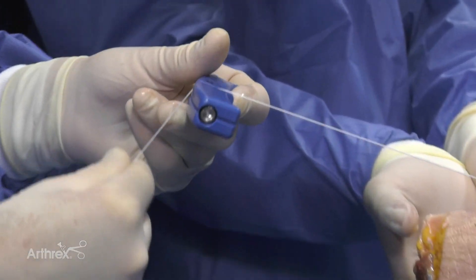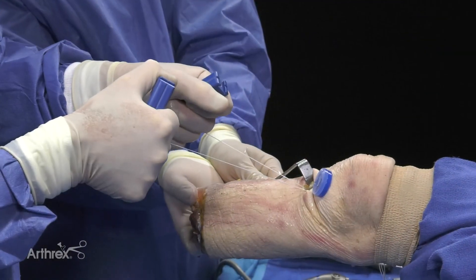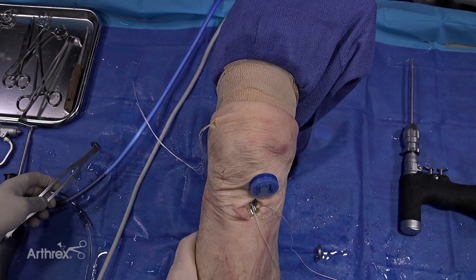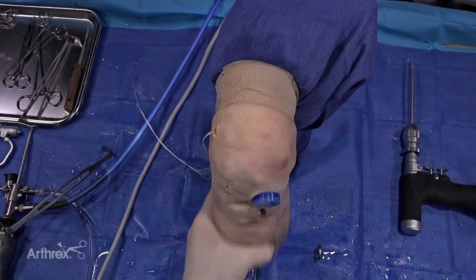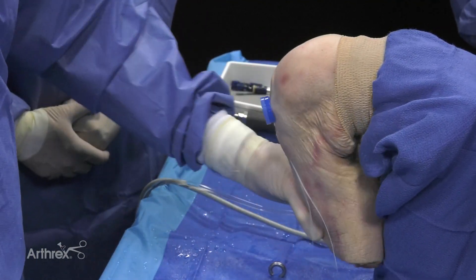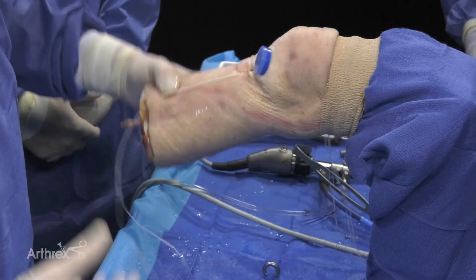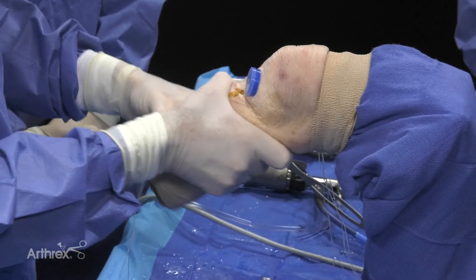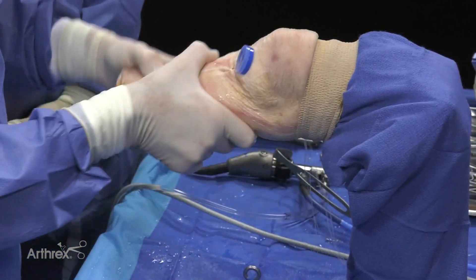I like to use the tensioning handles because you can get additional strength, and it's a lot easier on your fingers. Now I like to cycle the knee — very vigorously at this step — taking the knee through a range of motion 25-30 times. Put a little drawer, Lachman on the graft — any creep I'm going to get out of the system. This is the advantage of the all-inside technique with suspensory fixation on the femur and tibia: I can re-tension and take out any slack in the system that might happen from ranging the knee. Lachman, pivot — I do it intraoperatively.